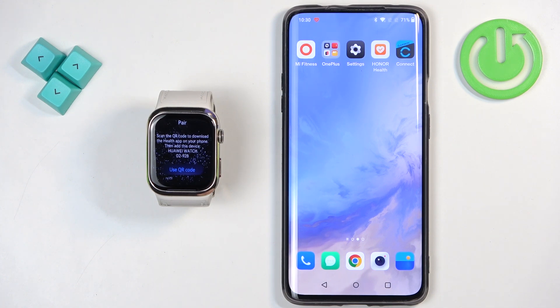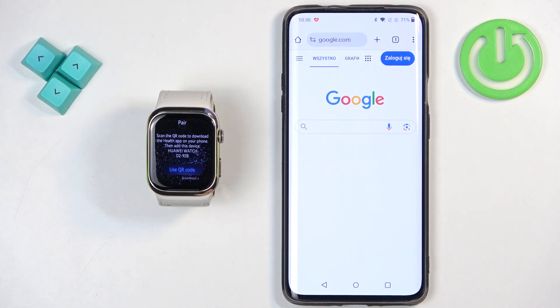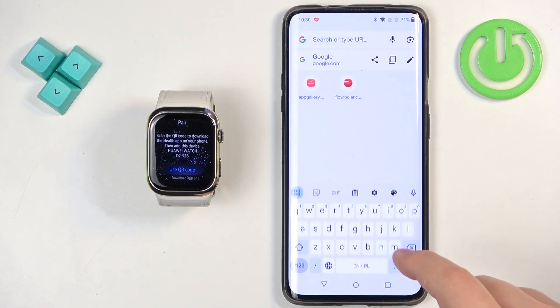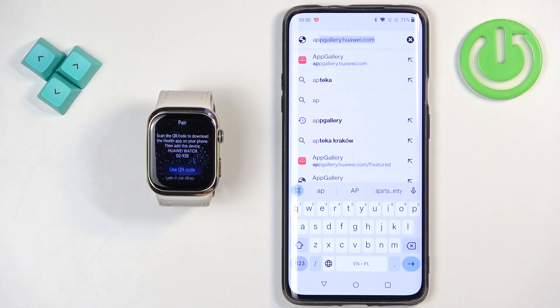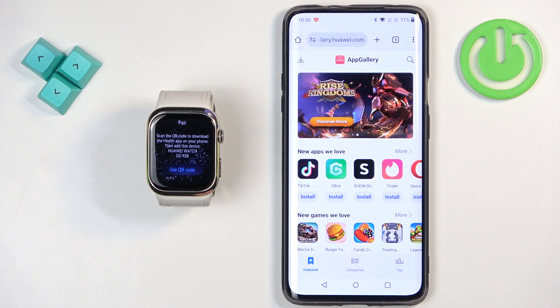On Android it's a bit tricky because we need to first install the Huawei App Gallery and then use it to install Huawei Health. To install the Huawei App Gallery we need to open the web browser on our phone. Tap on the browser icon, for example Chrome, then tap on the search bar and type in appgallery.huawei.com. Once you type it in, tap on search and it should bring you to that page.